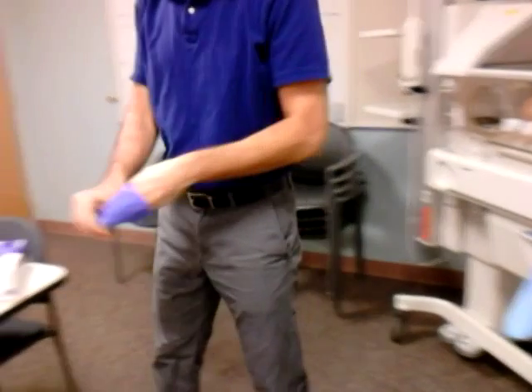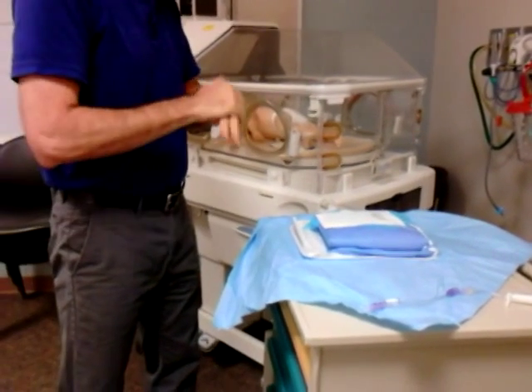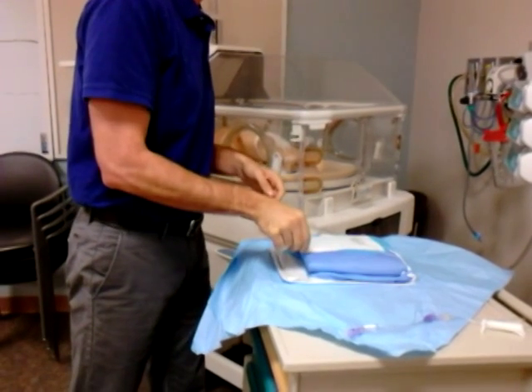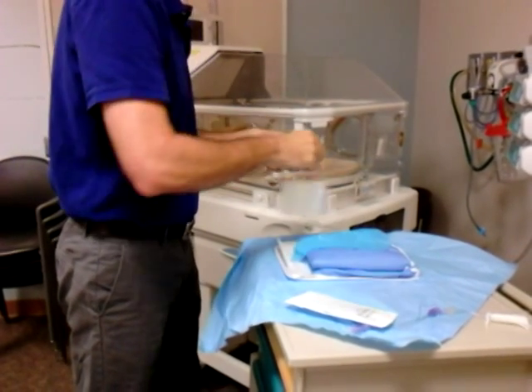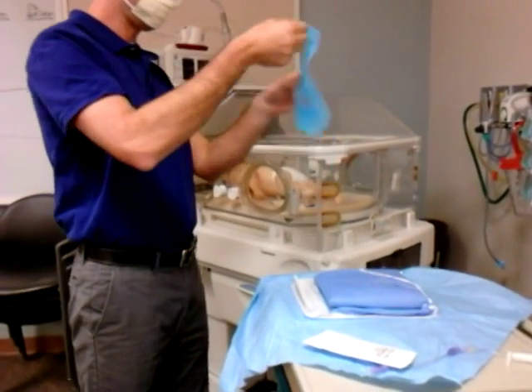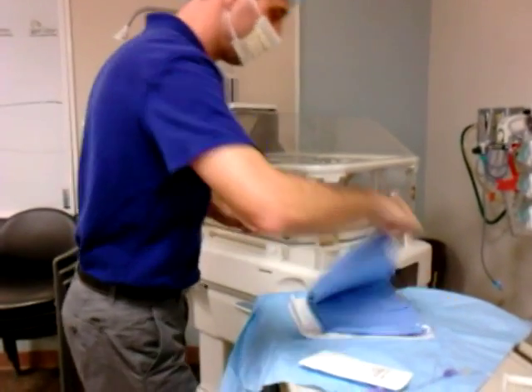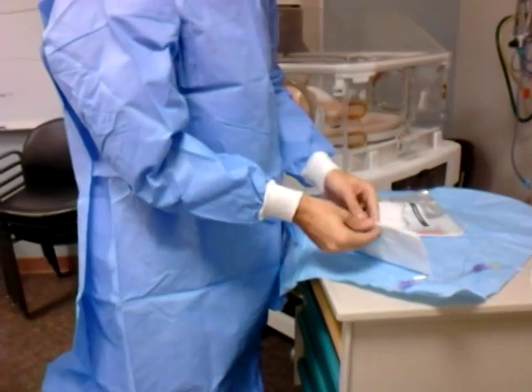Then we're going to take off exam gloves and gel our hands. Next we're going to put on all of the sterile apparel that's in the kit. We're going to put our hat, our mask, our sterile gown, and our sterile gloves on.